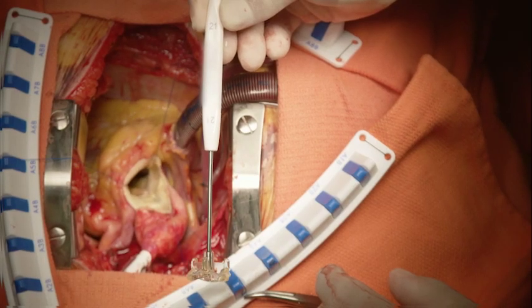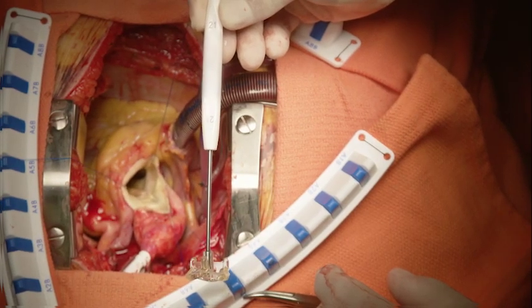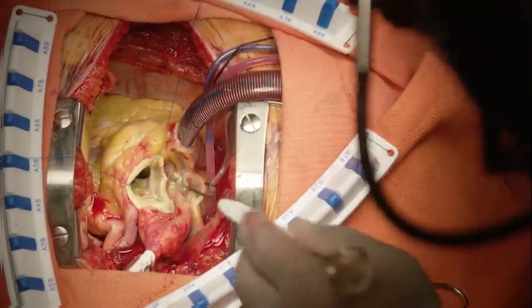This is a 21-millimeter Avalus sizer. The barrel sizer and the replica model both go through the aortic annulus easily.